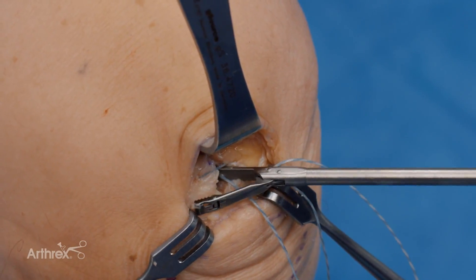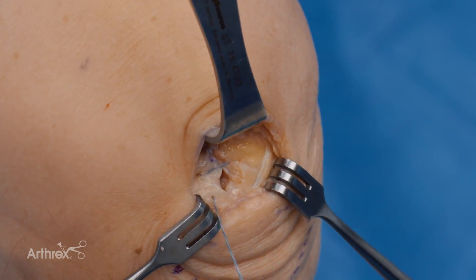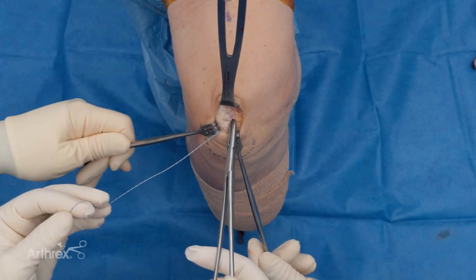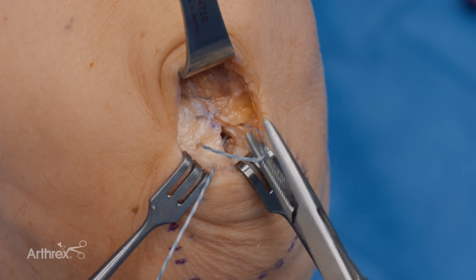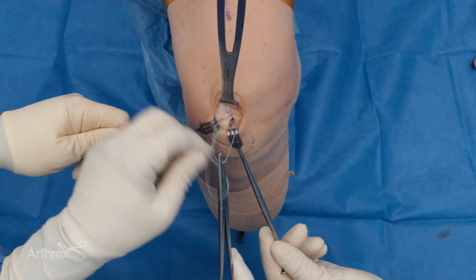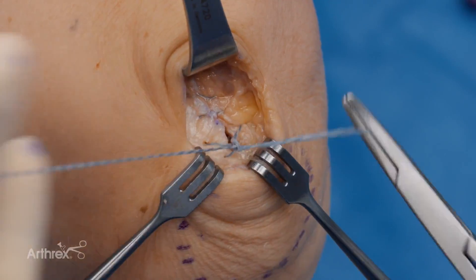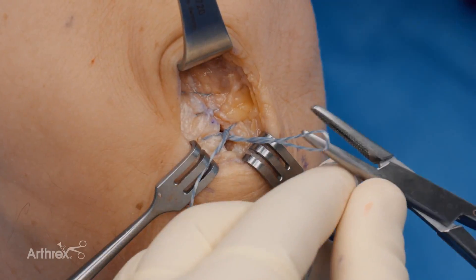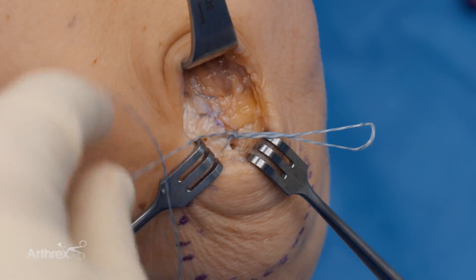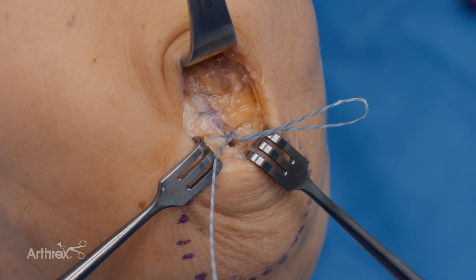You could do this with a free needle if you find the scorpion is a little awkward. In order to tie this off, you want to tie the final limb to a loop. So you take the last pass and create a loop, and then you're going to come around. You want to grab each end to figure out which one is the one that's going to tighten the sutures in the tendon. You can see how nicely that brought the sutures together, and you can see how it closed it down very nicely.